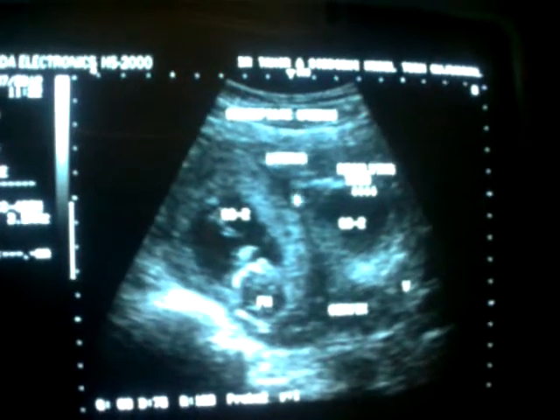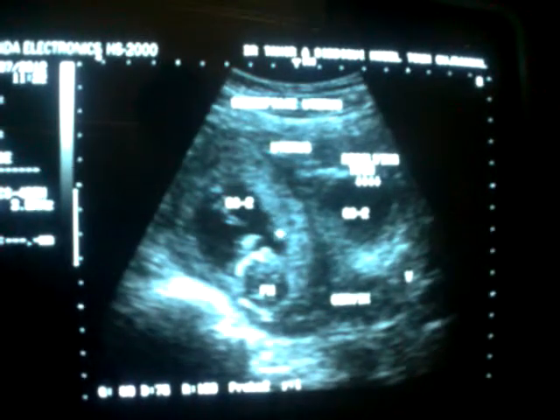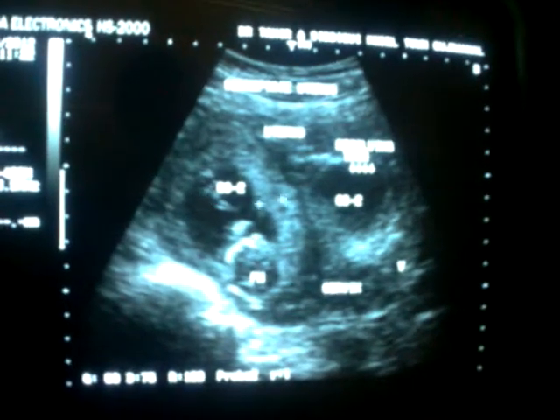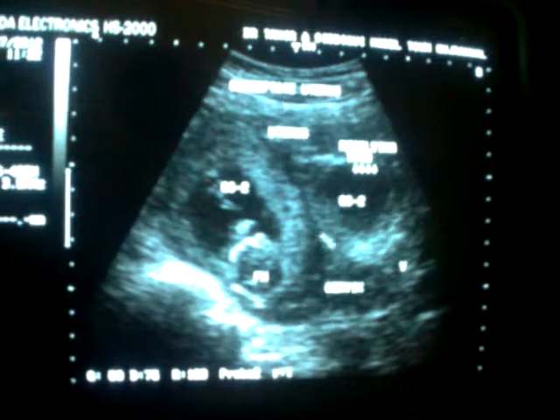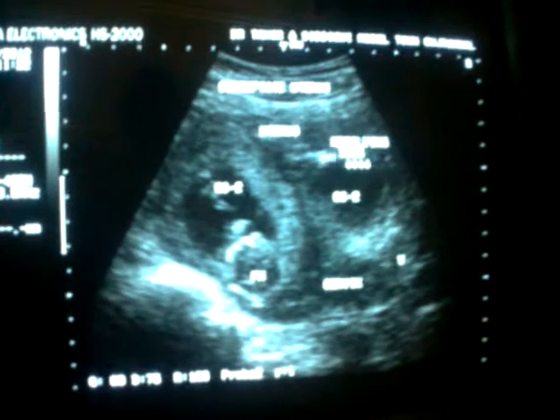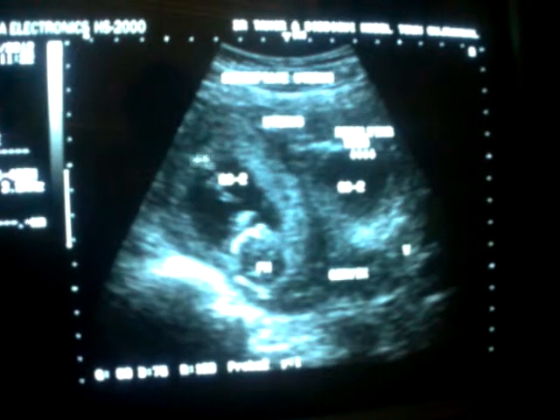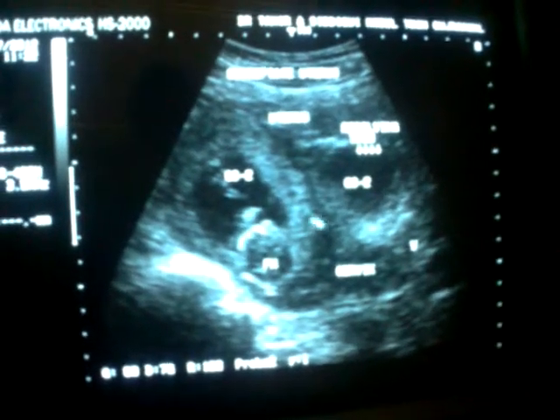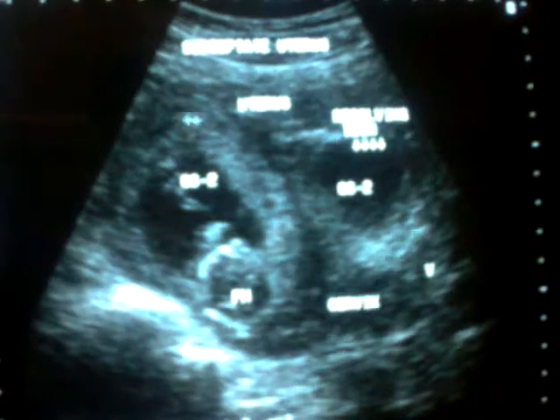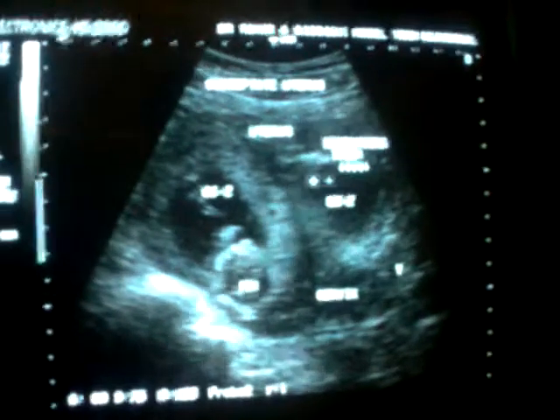Because if there had been an indentation, then this would have been a bicornuate uterus. Now there are two pregnancies, two gestational sacs seen. This one is a gestational sac with double decidual reaction. Double decidual reaction is the thick echogenic ring around the gestational sac, and the other one is this one. This is gestational sac number 2 with a thick echogenic ring around, which is the double decidual reaction or the trophoblastic reaction. This is the fetal head, whereas this sac is empty.